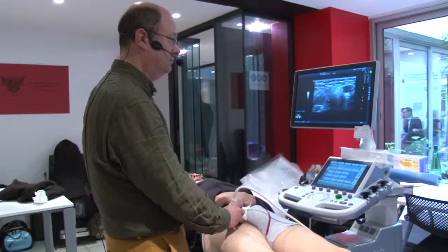Okay. Just now, Philippe is ready to go. Okay, Philippe, up to you.